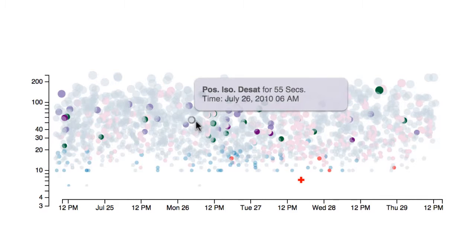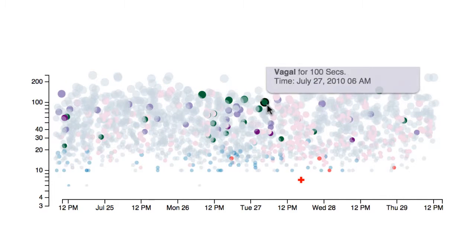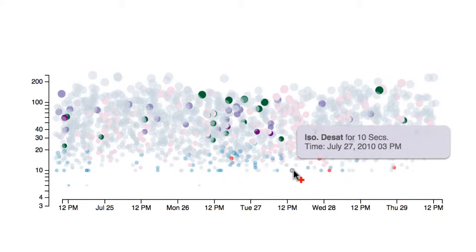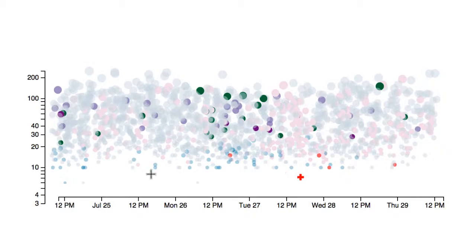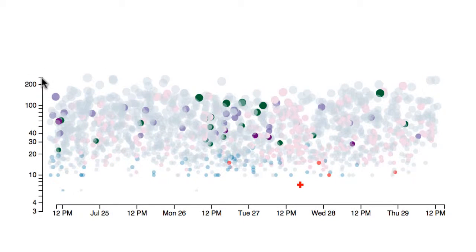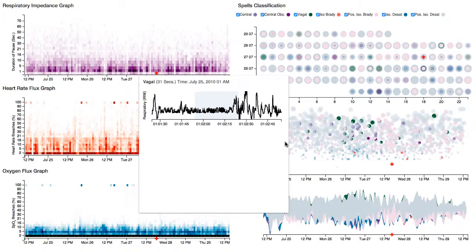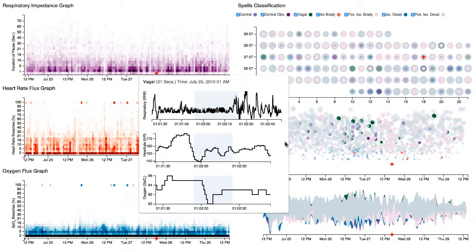The linear graph provides a user with an ability to see classification of events linearly as occurring over the analysis period. This linear graph transforms all classifications to a log scale expressed on the vertical axes. The vertical position and size of the bubbles double-encode for duration. Opacity is controlled to highlight various event clusters. The user is able to click on each bubble to reveal the raw data signal that corresponds to particular classifications. These raw signals may also be used to validate that their classification is correct.